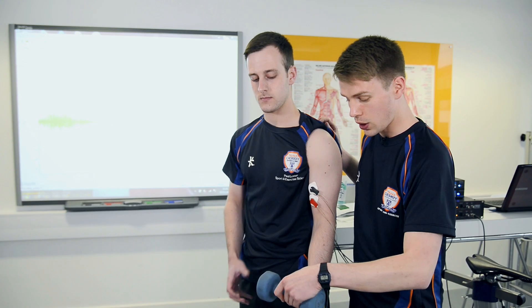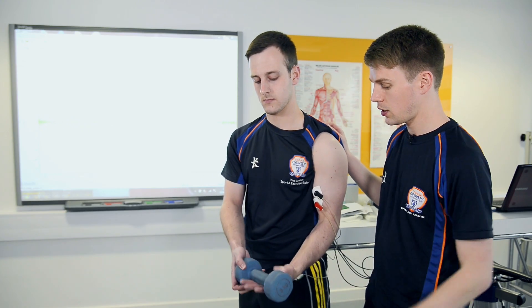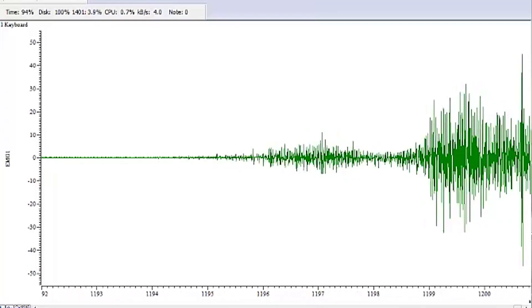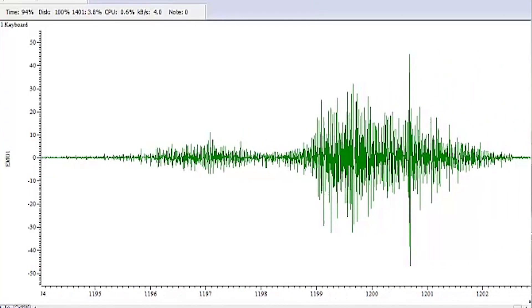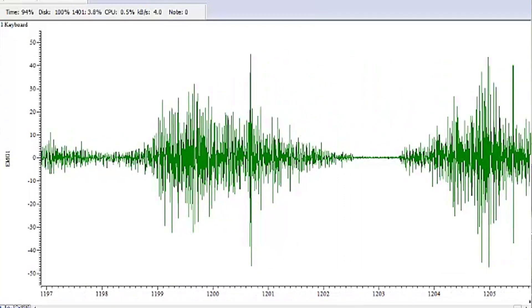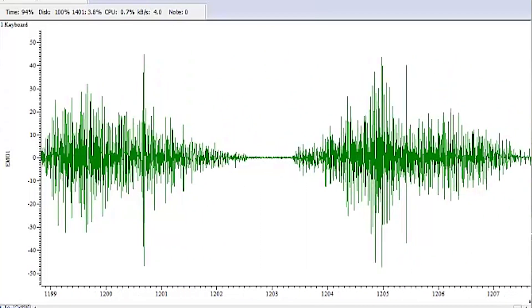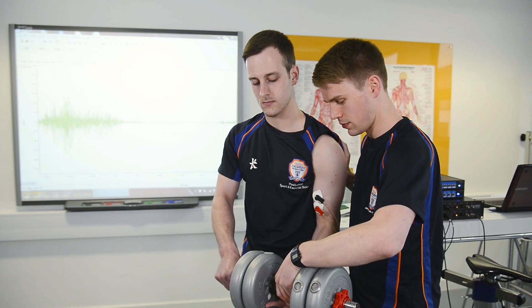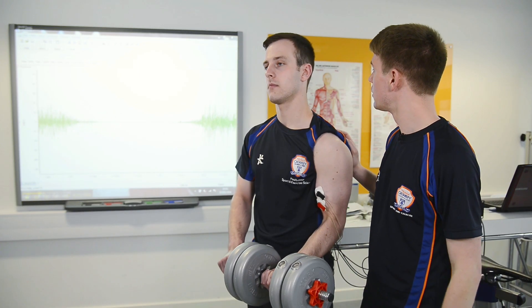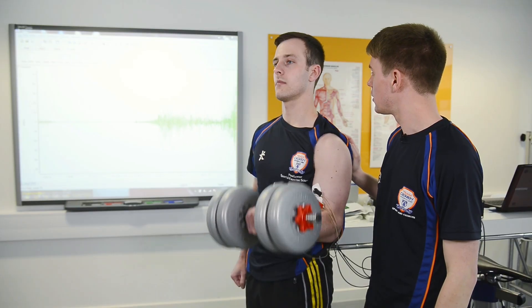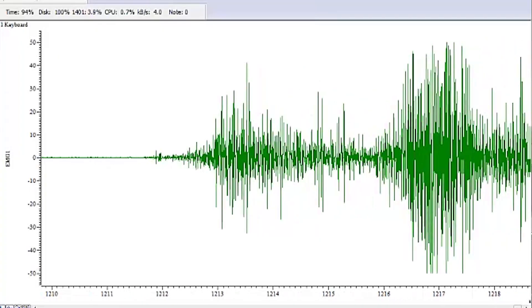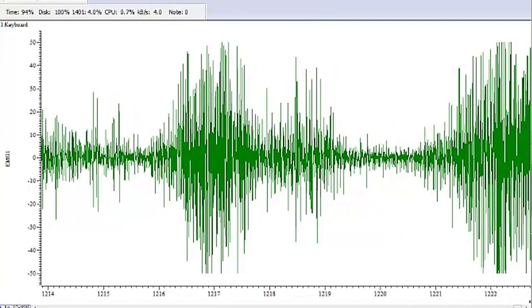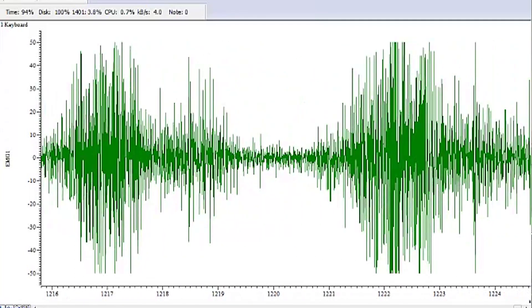Now, if Paul holds a small weight and repeats the same action, the EMG amplitude is larger, indicating that more motor units are firing. And if we replace that weight with an even bigger weight, the EMG trace is larger still. Remember, this shows motor units firing and the electrical activity spreading across the muscle.